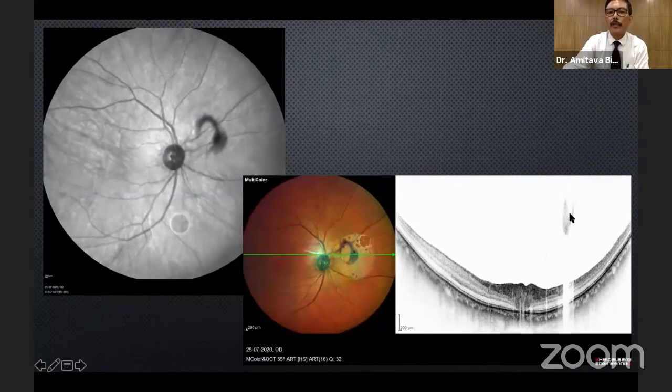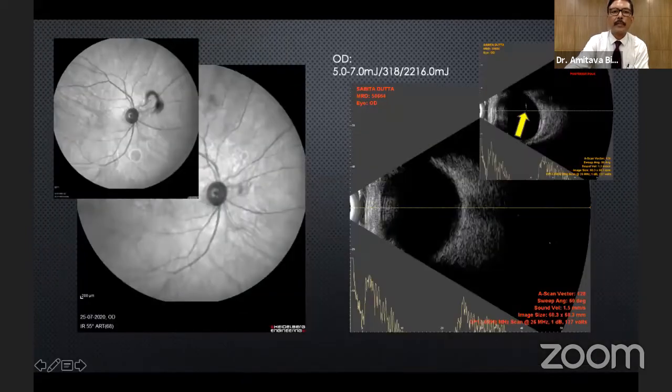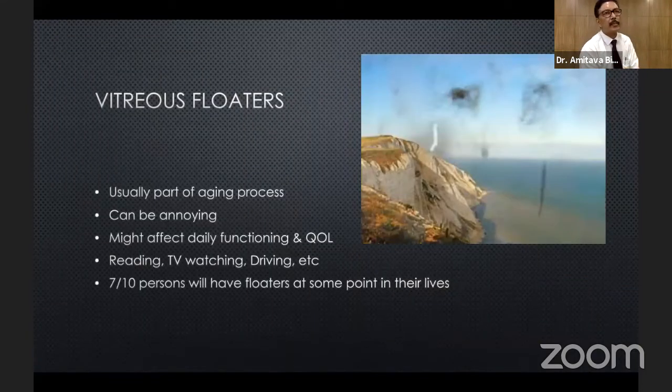And this shows the OCT, and you can see the ring in the vitreous cavity in the OCT tracing. And post laser today, I did the laser today, and the Weiss ring is not there. You can see in the ultrasound also that it is not there. She is very happy immediately. So the important thing is this procedure gives a dramatic instant relief to the patient.